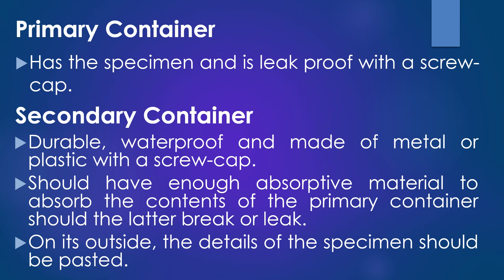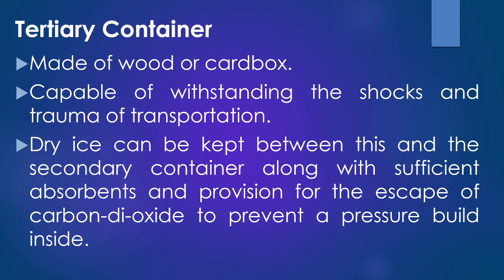On its outside, the details of the specimen should be pasted. The third container is the tertiary container and it is usually made of wood or cardboard box. It should be capable of withstanding the shocks and trauma of transportation. Dry ice can be kept between this and the secondary container along with sufficient absorbent and provision for the escape of carbon dioxide to prevent pressure build-up inside.